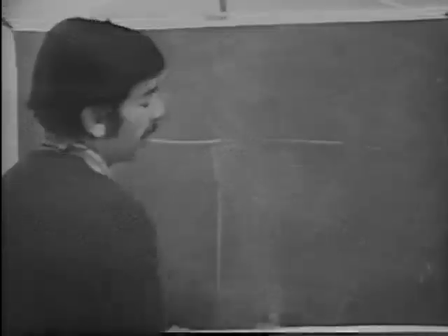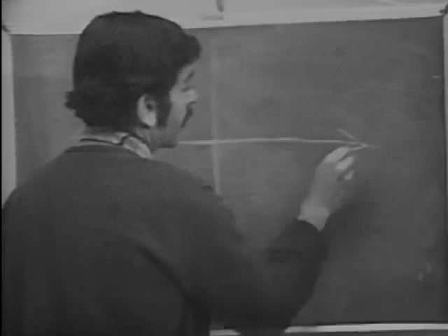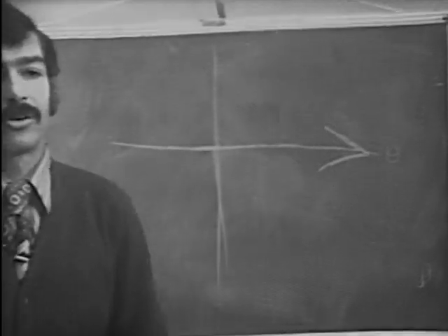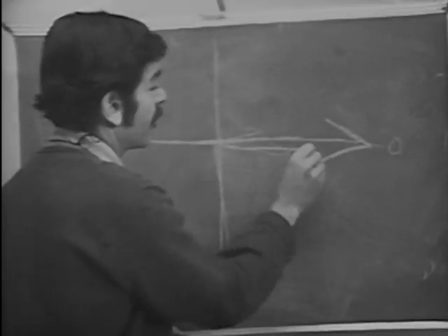Well, then let's talk about the exception. Suppose we have a mean axis of the QRS which is going like this. Suppose we have a mean axis of the QRS that's 0 degrees. We've determined it, and it turns out to be 0 degrees, right? And our principle was that all of these axes should be going in the same direction. The T wave should be going this way. The P wave should be going the same way, okay?